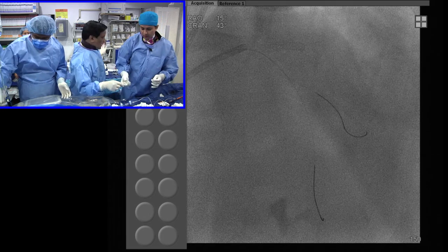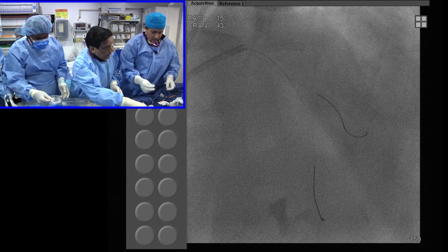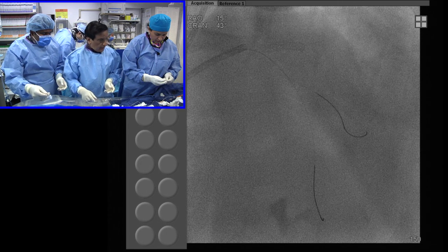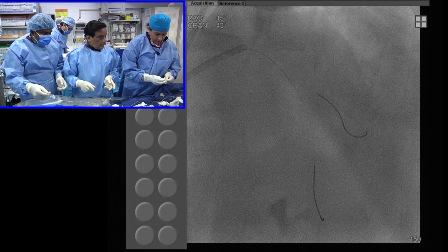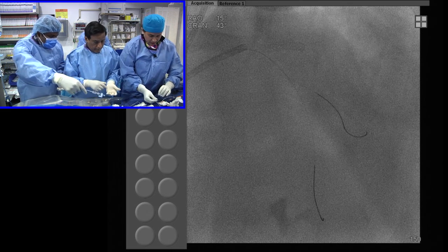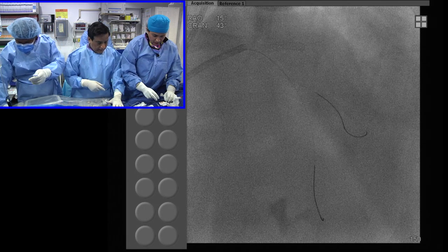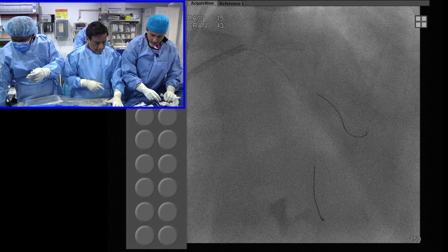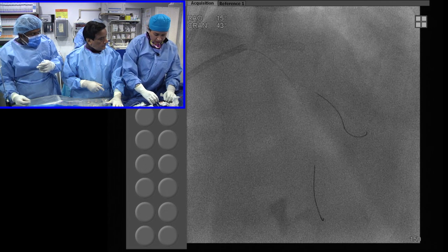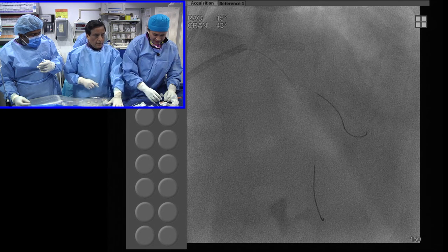Fine. Keep the 2.5 balloon. We are going to crush, not moving it too much. Talk to the patient. Give some medicine. What needs to be done? Because there will be less problem in going further. Okay. Anyway, we'll put a balloon in the main vessel. We'll do a little stent crush for the diagonal now? Yes. No, you want it simultaneous. Earlier you said you want simultaneous. No, simultaneous, but first you have to crush. Oh, the ostium. You're talking.